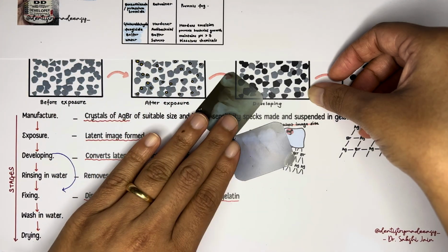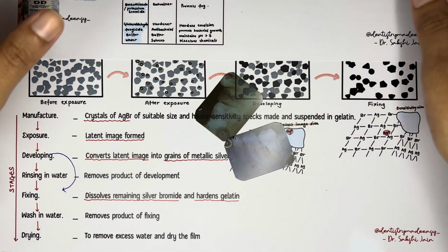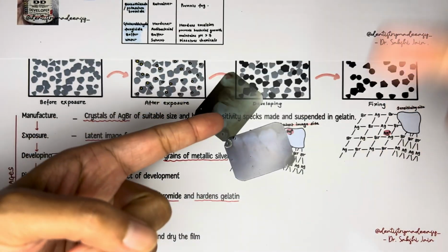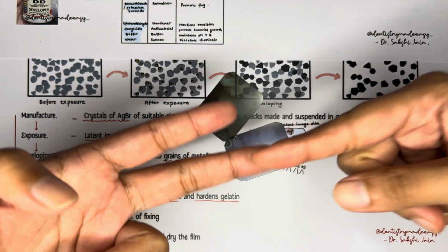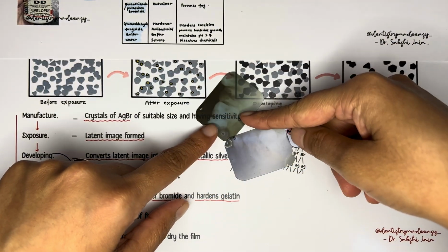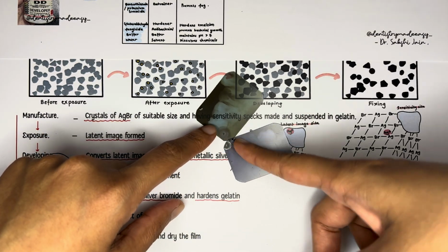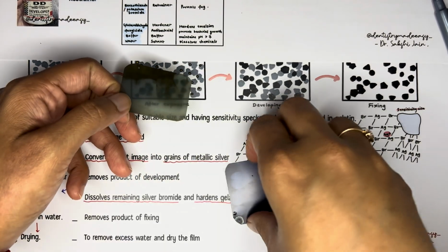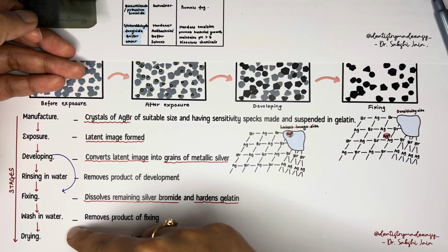So if the processing or the technique of radiograph is not going well, in that case what you need to do is exposure again. First thing, exposure is going to increase, the radiation dose is going to increase. The next thing is the processing part will also happen twice, and this work in itself is time consuming, so you don't want to do everything again. So in that case, please follow proper procedures, please follow proper steps when you're doing the processing also.